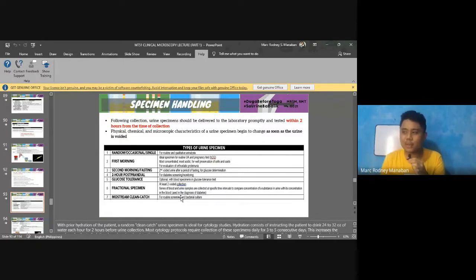So makating ka na, sir, what if late ko tigmata? What if alas 12 ko tigmata, sir? First morning bagya po na akong ihi pag ihi na ko ana. Yes, basta imong unang ihi na mapagawas pag bangon nimo. All right, that's first morning.